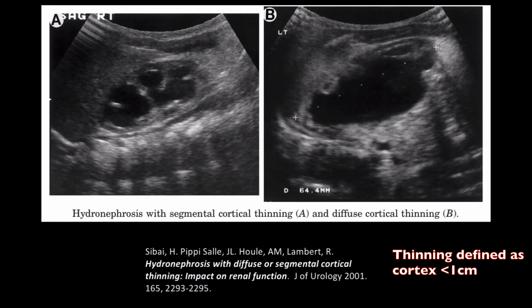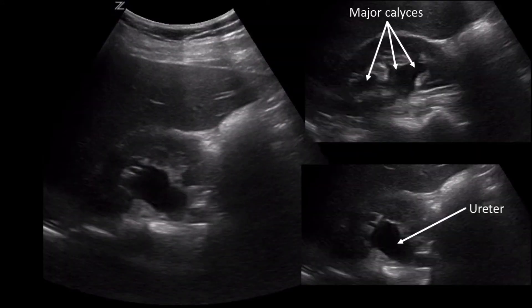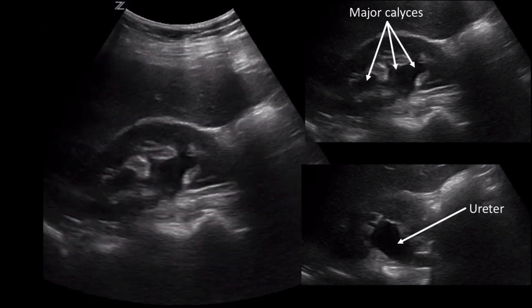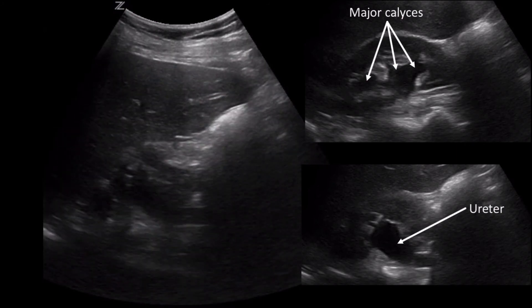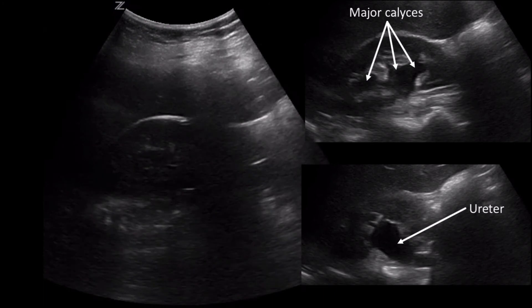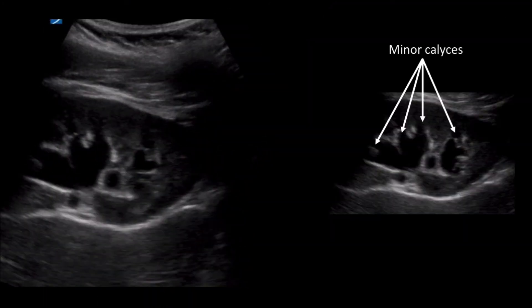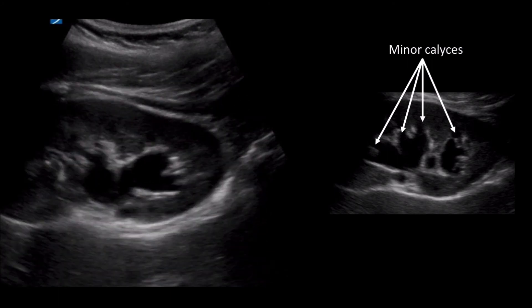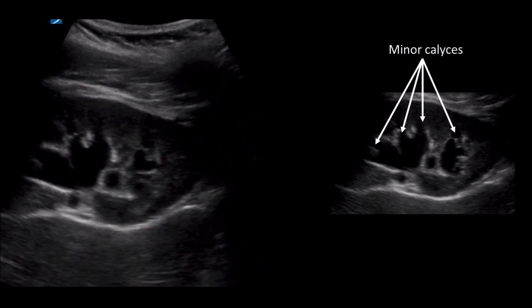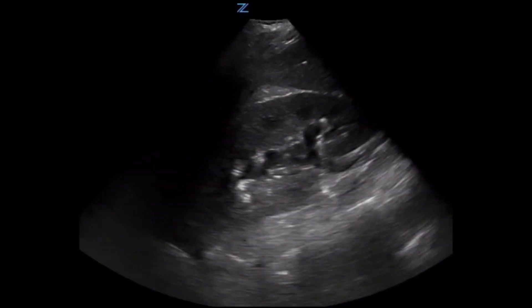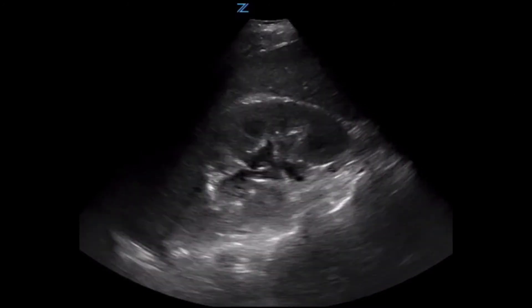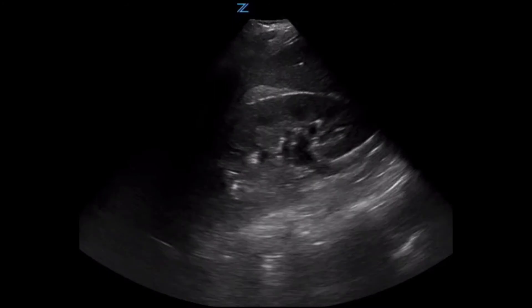These two pictures show great examples of cortical thinning. If this is present, you should think of a pathology resulting in long-standing obstruction. Now let's review a few examples of hydronephrosis. I've identified dilation in the major calyces and ureter in the still shots on the right. Here's another example where we can clearly see dilation of the renal sinus extending into the major and minor calyces, representing moderate hydronephrosis. Here's a more subtle example where the majority of dilation appears focused within the major calyces, representing mild hydronephrosis.